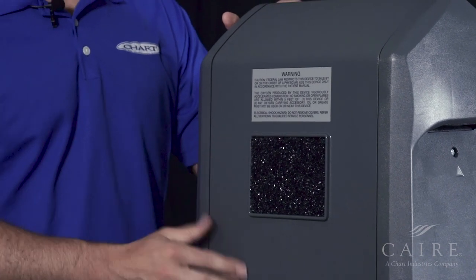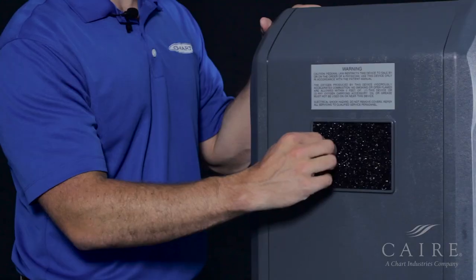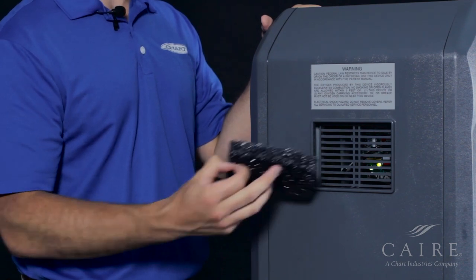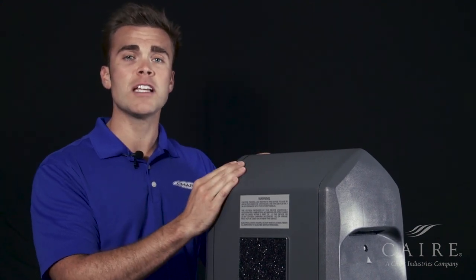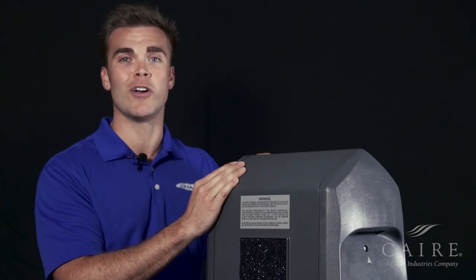Last thing we'd like to point out is that we do have a filter on the back for this unit. Simply take the filter out once a week, wash it in the sink, make sure there's no debris, and make sure it's dry. Simply reinsert it, and there you have it — that's the basic functionality of our New Life Intensity unit. Thanks for joining us. If you have any questions, please feel free to contact us. Until then, have a great day.